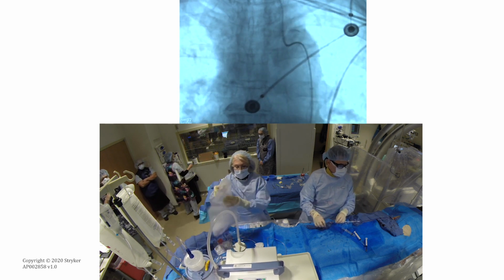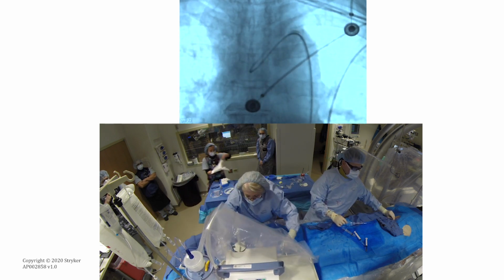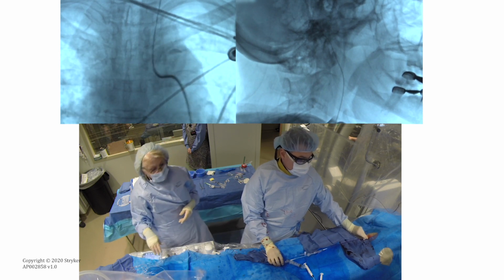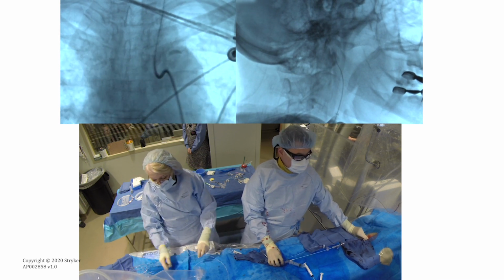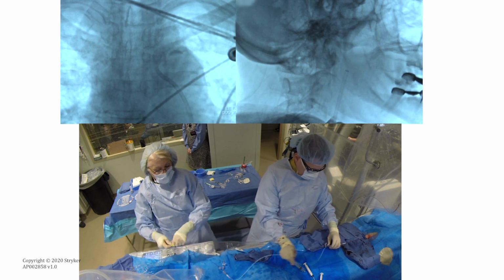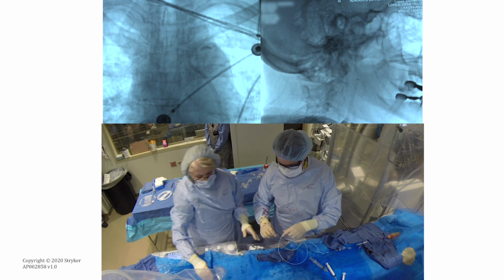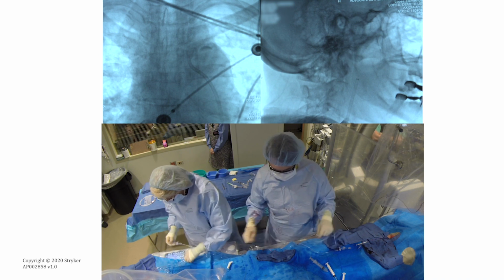a VTK inner catheter in this case. In many cases we can use the inner catheter that comes in the insert, certainly for the right common and left vertebral. For the left common carotid artery, in general, the VTK seems to work better, and you can see the tortuosity in this particular case, which is why we chose it. After getting relatively fast access to the left common carotid artery, we park the FlowGate 2 in the common carotid artery and obtain initial imaging of the anatomy prior to advancing into the internal carotid artery.